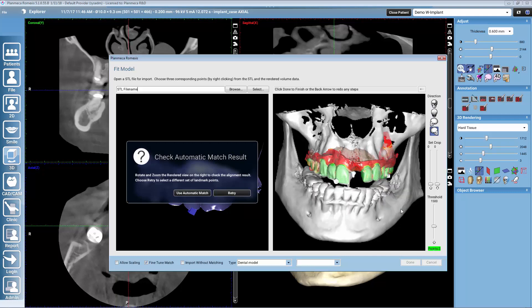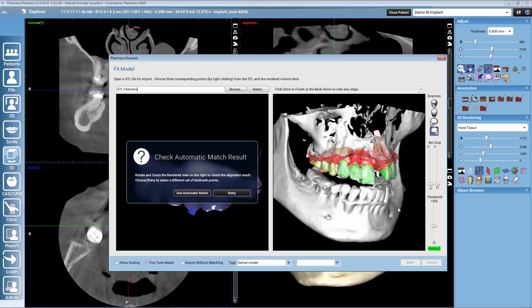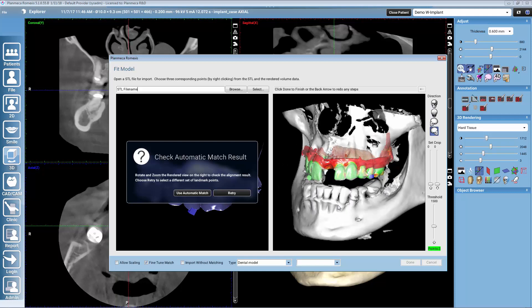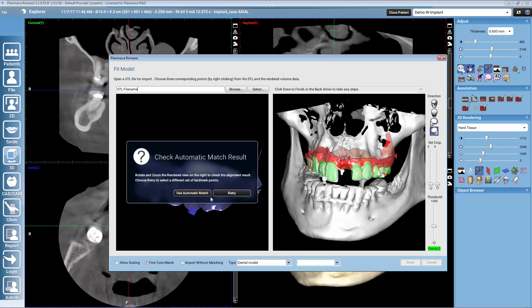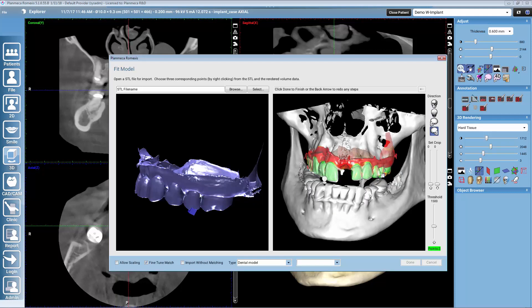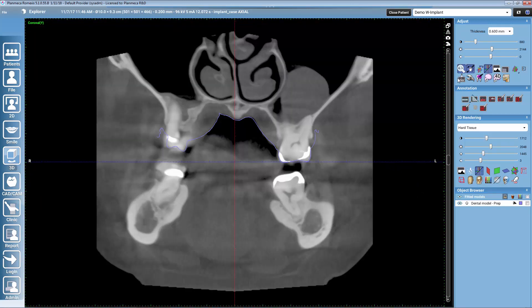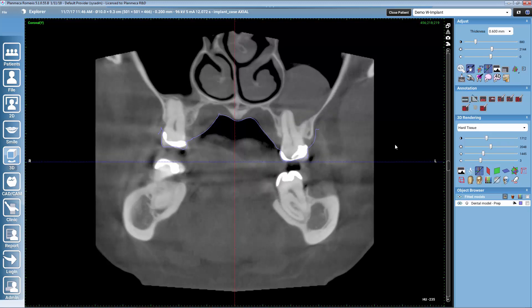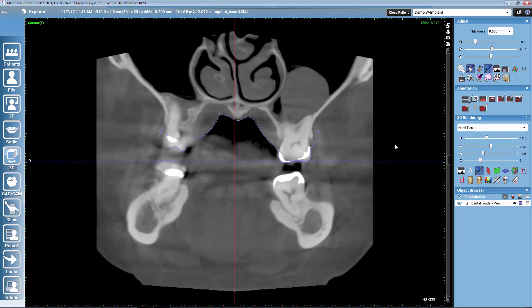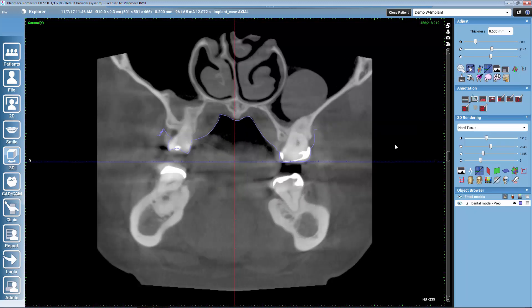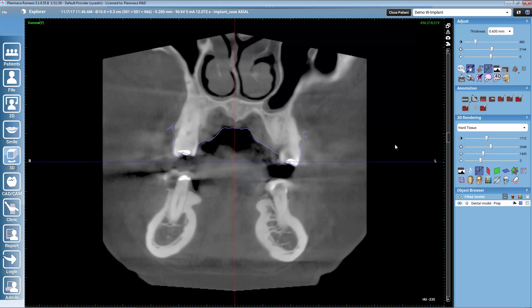Romexis shows a deviation map. When the crowns are green and the gingiva is red, the match should be good. We select to use automatic match and then we verify the match, for example from the coronal view, by scrolling and checking the fit of the STL model to the CBCT volume.